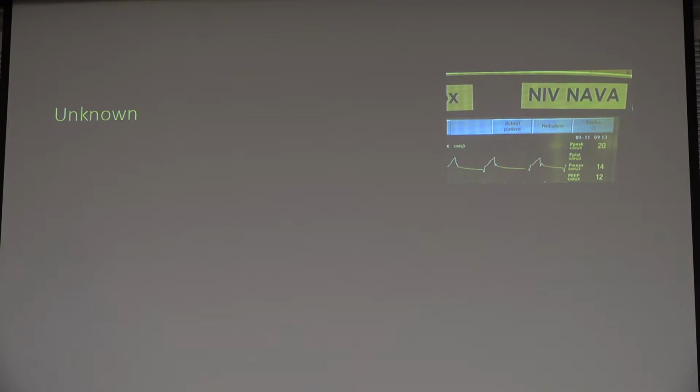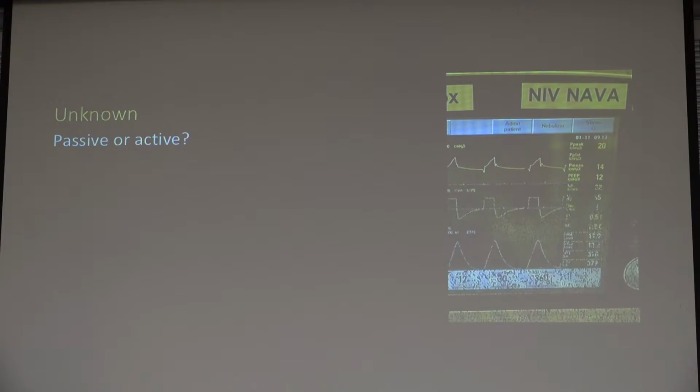Let's take a look at this patient here. Again, I'm not giving you all the information you need right now, but can you look at that and say, is this person passive or active? Active, yeah. We have veteran respiratory therapists here. So we know the patient's active.